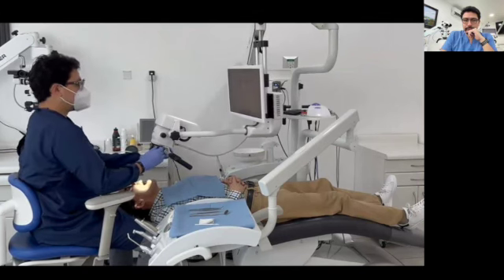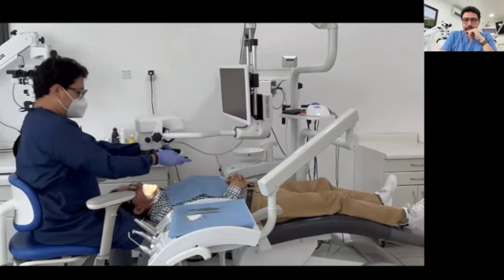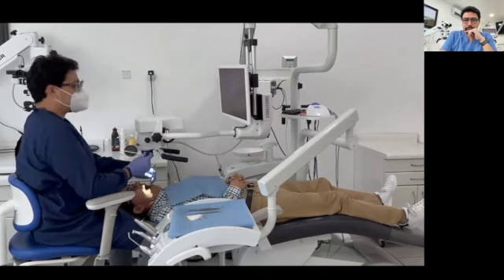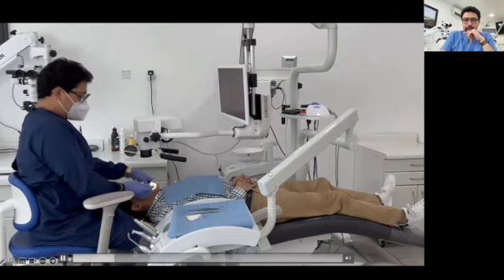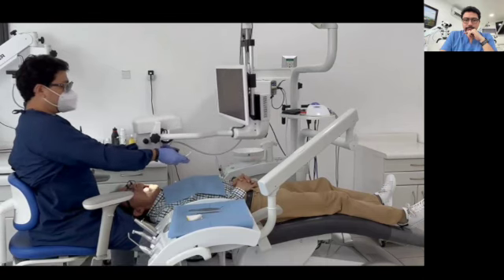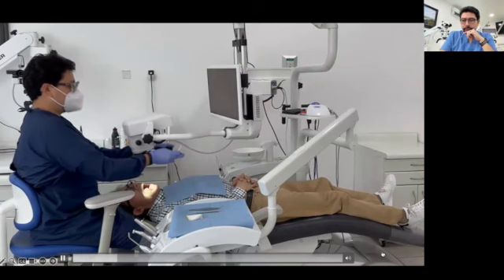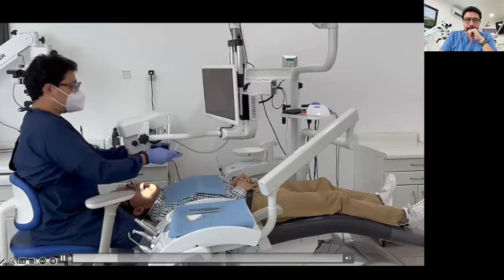During the next minutes, I will show you some examples related on how to angulate the optical pod, on how to position the patient for working in some areas of the oral cavity, but these are just examples. The final setup will rely on the procedure to be performed.